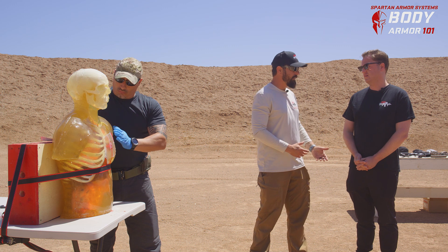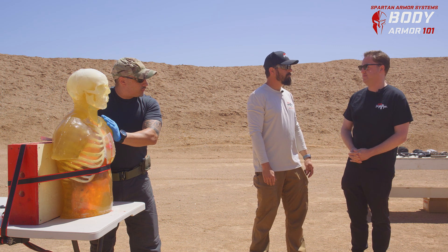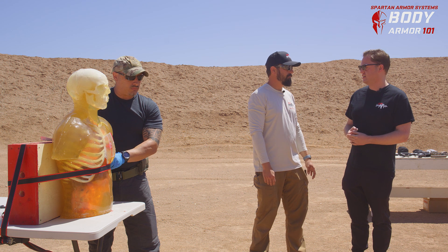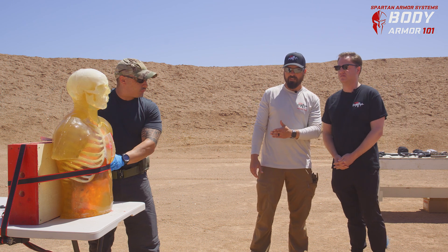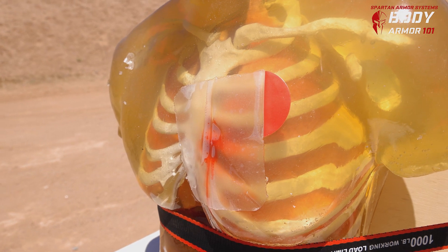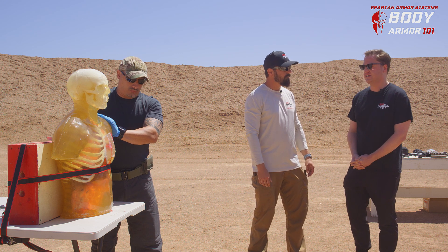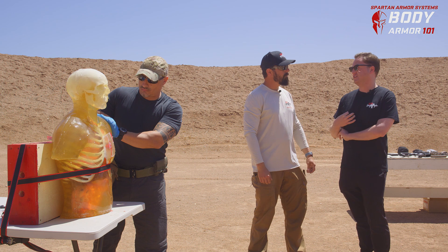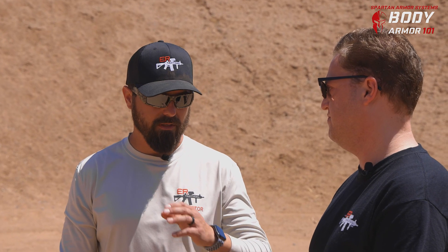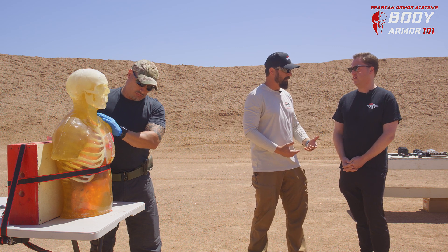He's got an occlusive dressing on the front and goes right to the back looking for the exit wound, because if you let one of those sides go it will continue to collapse that lung. Our colleague cleared away the blood to get a good airtight seal. These temporary measures prevent more air from entering the chest and stop the pathologic process. Because it's the chest and lungs, there's not a lot of blood coming out — that's normal, which allows you to get a definitive airtight seal. Each kit comes with two of these dressings — very important for your entry and exit wound. The occlusive dressing allows air to go out but not inward. The training and equipment kept this guy alive to get to higher echelon care.